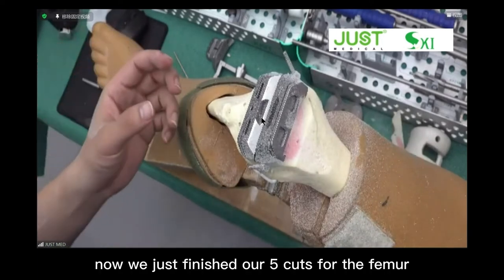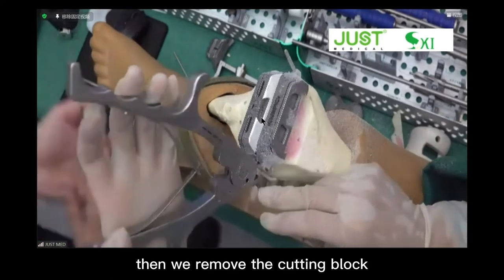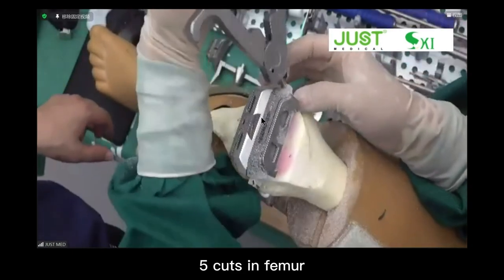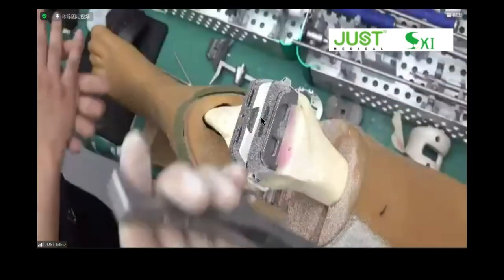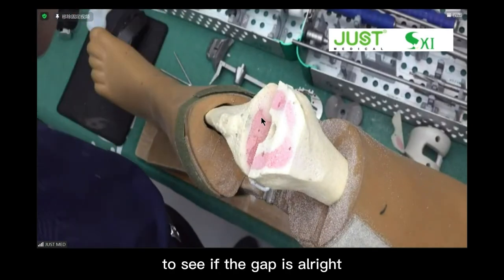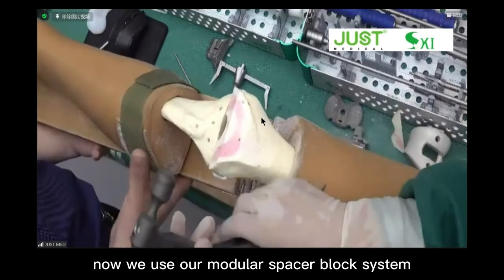Now we just finish our 5 cuts for femoral. Okay. Then we remove the cutting block. So we did 1 cut in the tibia, 5 cuts in the femoral. Now, after that, we're going to do a gap assessment to see if the gap is all right. Yeah, we use our modular spacer block system.